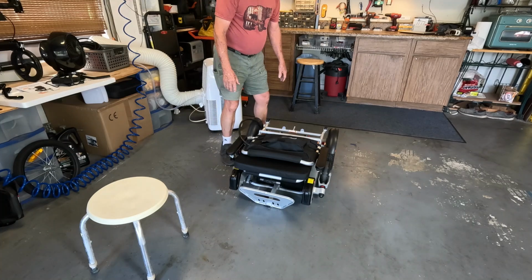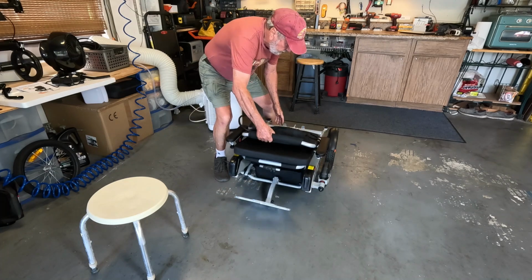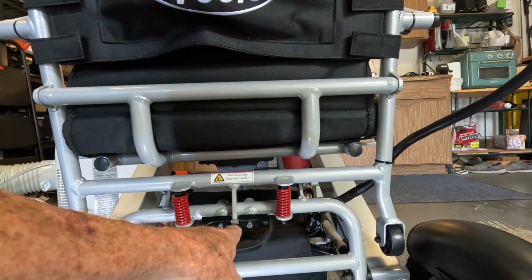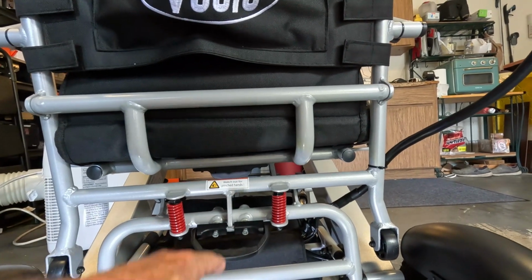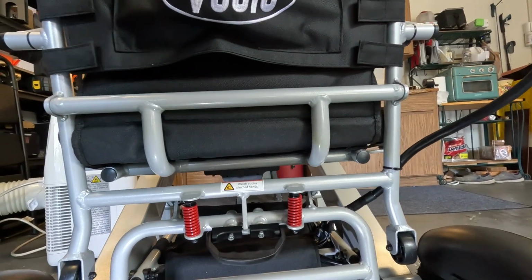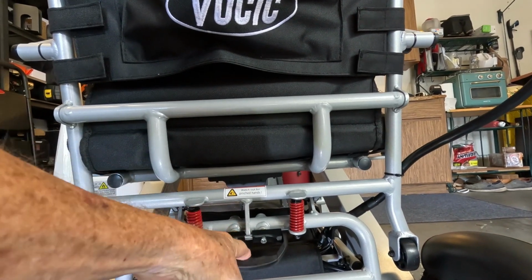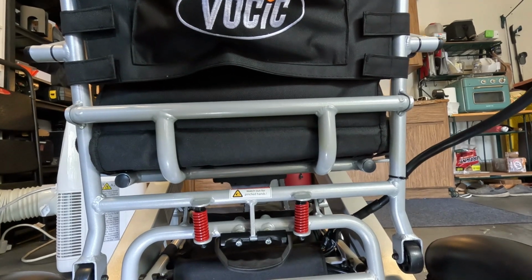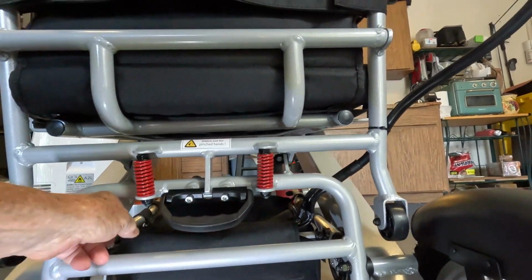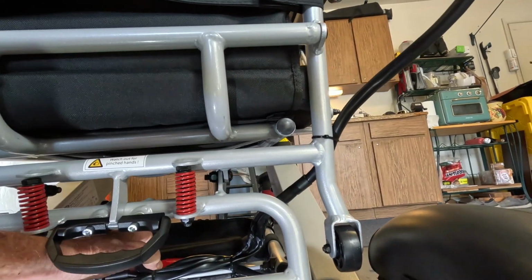When it's like this, you want to open it up. You just grab the back of the chair right here and then just pull until you hear a snap. That's this part here snapping into there, and that's what holds the back in place. When you go to fold it back down, you're going to push this and then fold it back down. We'll show that later.